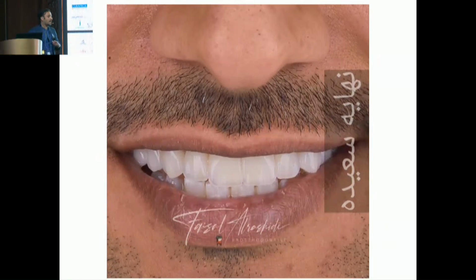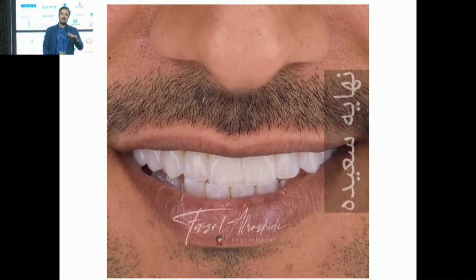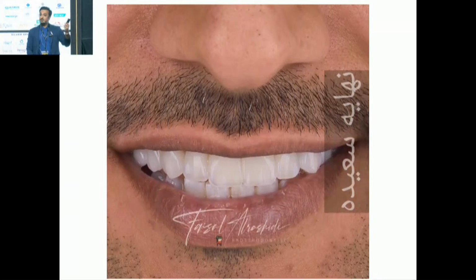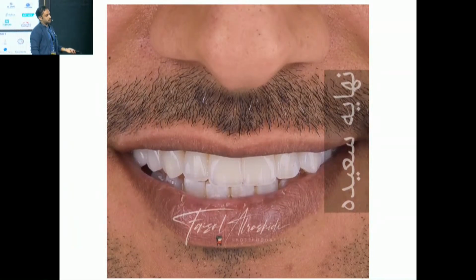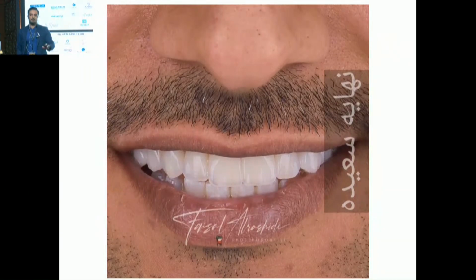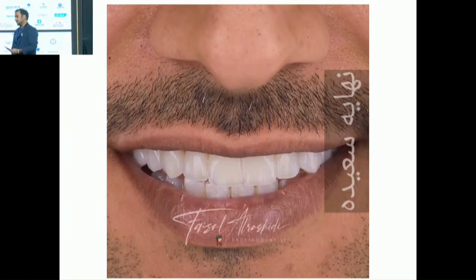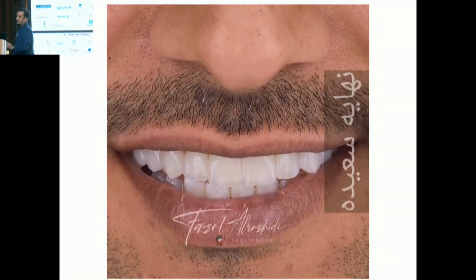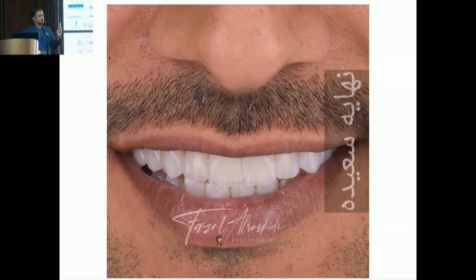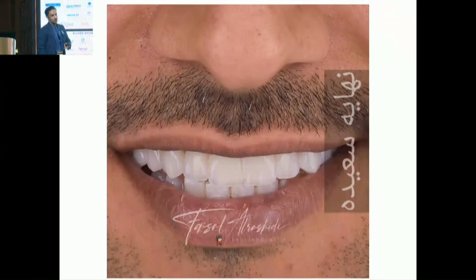And what I mean by digital workflow is not only scans. We're not only using a scanner. We're using a scanner, we're using a designing software in the lab. It depends. Different labs have different softwares. I deal with different labs, so I deal with different softwares. And then after that, they process this final prosthesis, whether it was 3D printed, whether it was milled, etc. So this is what separates digital dentistry from analog dentistry, is the different tools that we can use with digital dentistry.